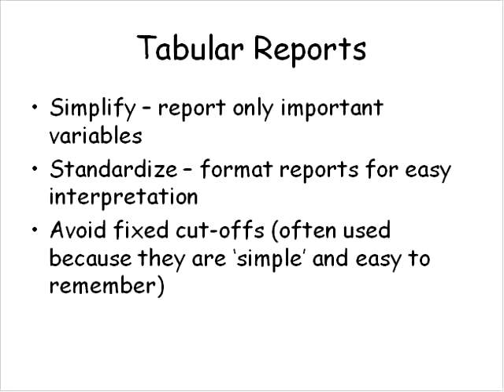Doing the spirometry first will also help you answer that first decision point on the algorithm that I showed you earlier. That is, does the patient have obstruction? And so that may help color the protocol that you decide to embark upon for the rest of the test. If the patient has obstruction, then you may decide up front that yes, in fact, this patient's going to need a bronchodilator, and so I'm going to use a protocol that will allow us to do that in the most efficient way. So I wish I had a better answer than that, but I think that that's an important question, and it's something that each lab is going to have to decide.